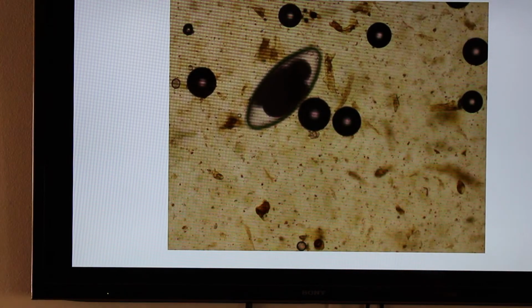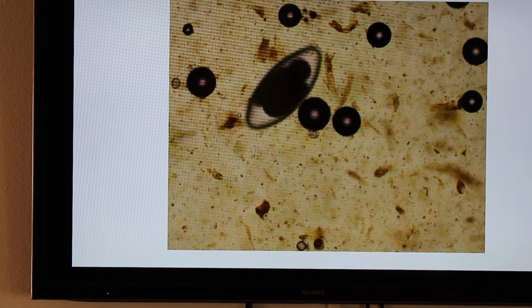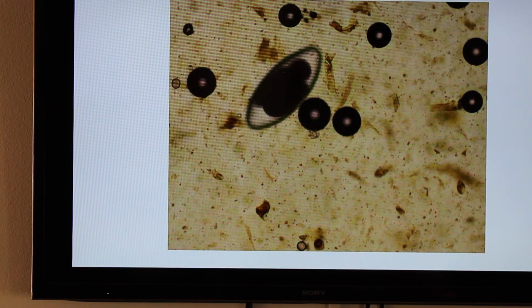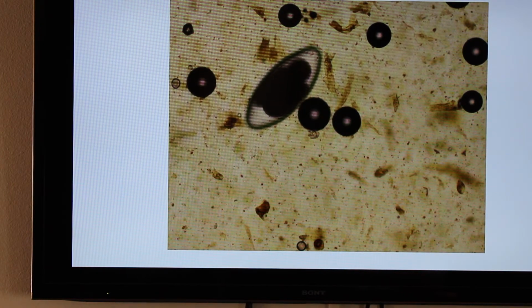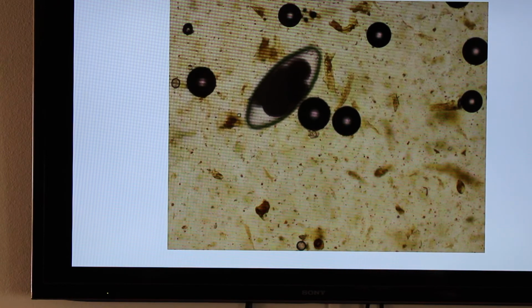This image comes from a bovine sample that I notated on your homework. So here we do have our air bubbles and then this large hookworm style egg. And in bovine, there's so many species and they're hard to differentiate. So we call them a trichostrongyle type.